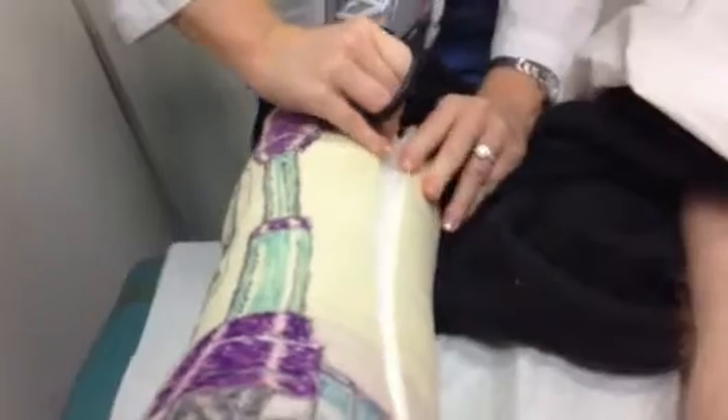Well, just a little. Not much. Because your pores are not breathing. Yeah. So what happens when you put the cast on? Actually, it'd be a hard time cutting. Just brute force, huh? I'm going to make it easier. I'm going to spread it a little bit. Let's see if I fall across. Because the rest of the stockinette is here. Pull up a little bit. Pull up slowly. Pull up slowly. Then I pull out a little bit. Because the stockinette here. And I come across. I think we're caught in that edge a little bit.